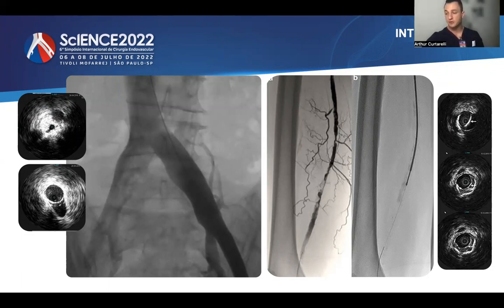But angiography has numerous limitations, such as identifying plaque morphology and geometry. Even when we apply biplanar angiography, the actual dimension, depth, and anatomic characteristics of the plaque elude these imaging techniques.